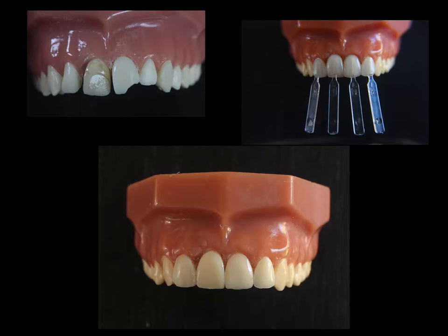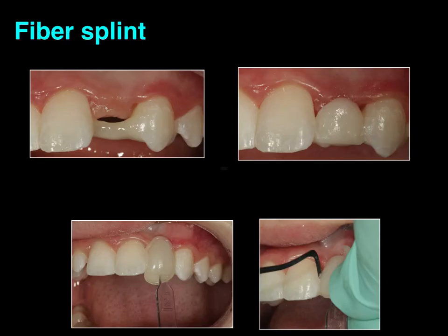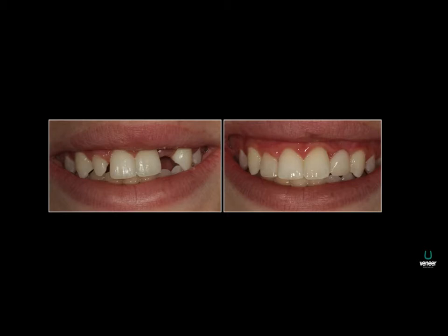Another thing we can do with the Uveneer is when you have a missing tooth, in cases of implants or extractions, when you need to wait for 3 months for healing of the soft tissue or the bone graft, I use a fiber splint. You can use Rebond or any other brand. You etch and bond the adjacent teeth, apply the fiber. I like to build the pontic with high fill flowable and press the Uveneer, clean the excess, and this is what you're gonna get.